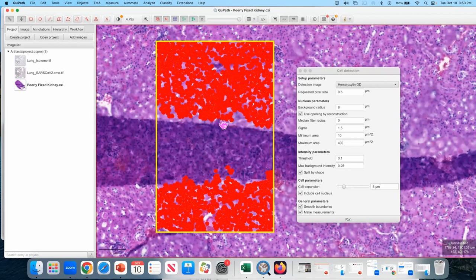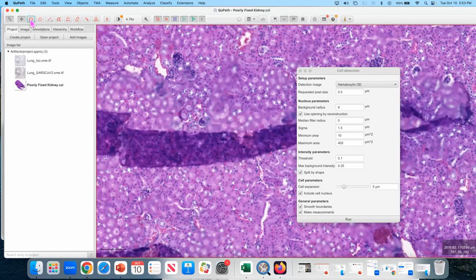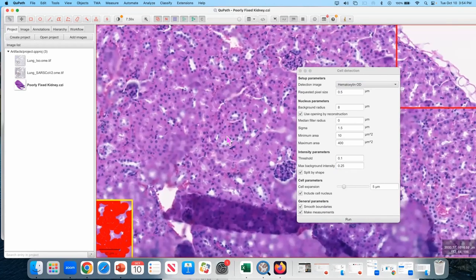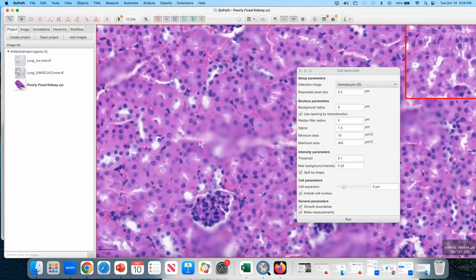Good. That's definitely enough. So just to recap, when dealing with folds, when you are doing your cell detection, you can adjust this max background intensity parameter, and that's going to take care of things that are folded. I find that I have a lot more difficulty dealing with areas that are out of focus. Maybe someone from the audience has some ideas of how to deal with them.